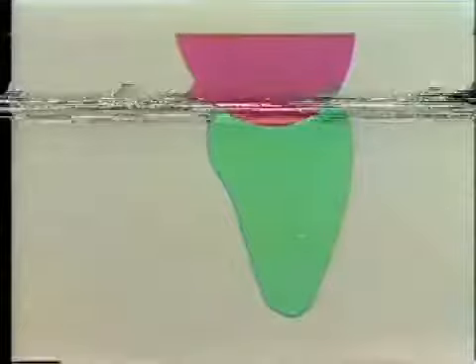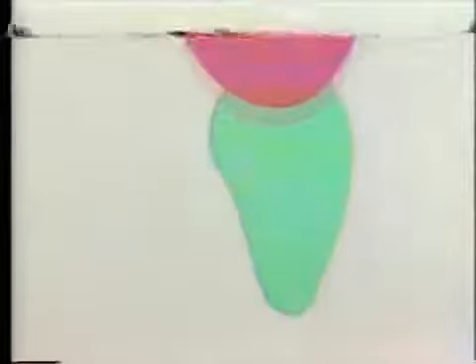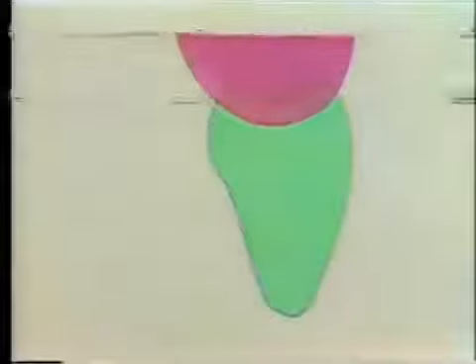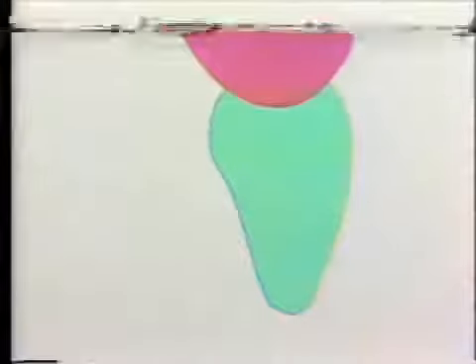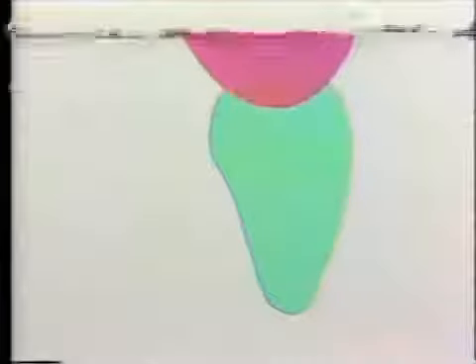This diagram is a labiolingual cross-section through a natural maxillary incisor tooth. The labial surface is on the right-hand side of the screen and the lingual surface is on the left-hand side of the screen. Following the extraction of this tooth, as you realize, of course, the alveolus will shrink away, as you saw in that dissolve. Back again now to the normal relationship of the natural tissue, and then as that fades away. Now you can see that if you were to just project the lingual and labial surfaces of the natural tooth form to meet the new position of the alveolus in a Pontic, the Pontic would be somewhat longer than the natural tooth. Certain modifications are made to deal with this situation.